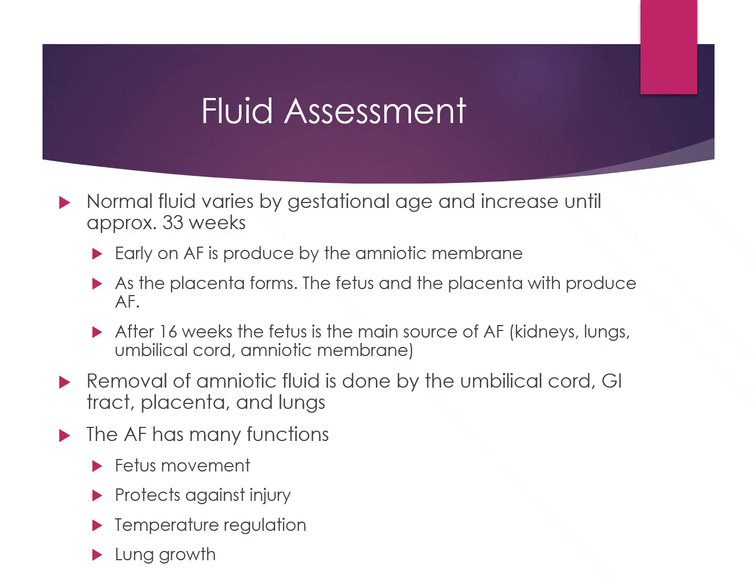So in the first trimester, we get mostly fluid and little baby. In the second trimester, it looks like that fluid is still perfectly surrounding baby. But once we get into the late second, early third trimester, or the third trimester, it's only going to appear in little pockets. So we're not going to have mostly fluid, little baby. We're going to have mostly baby with little pockets of fluid.